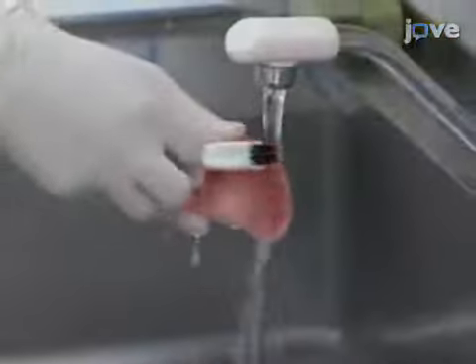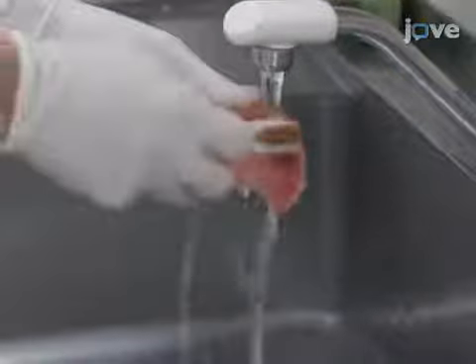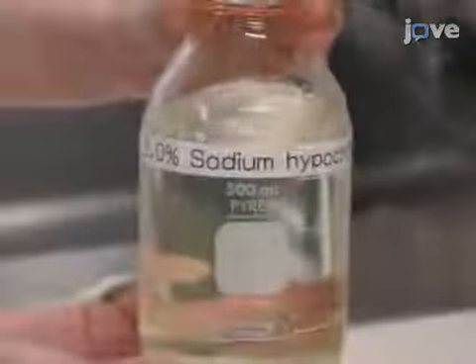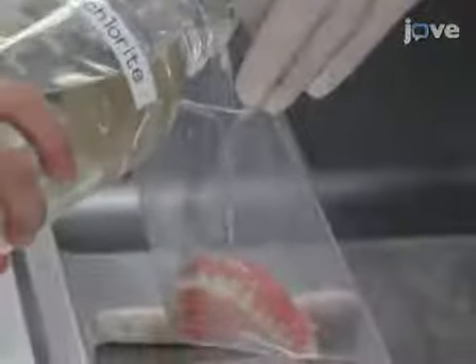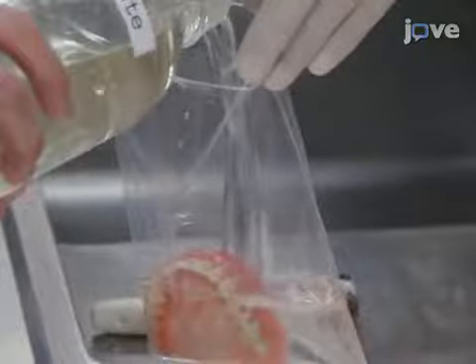Using a denture brush, mechanically clean the denture for 3 minutes. Then, chemically clean the denture for 5 minutes in an ultrasonic bath sonicator with a denture cleaner containing 2.0% sodium hypochlorite.